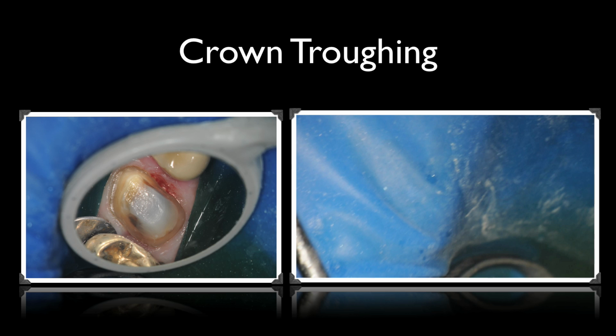So I do short brush strokes, and when the tissue builds up onto the laser, as it is here, you stop, have a wet gauze, and clean off the tip in a simple fashion. Have the assistant clean off the tip, just pulling with the gauze so that you do not cause a break in the fiber itself. You can see every once in a while that I get a little bit of a tissue tag, and we're now going towards the mesial.